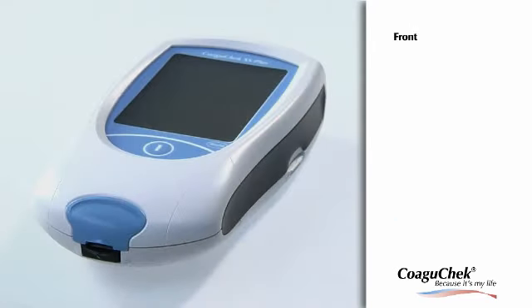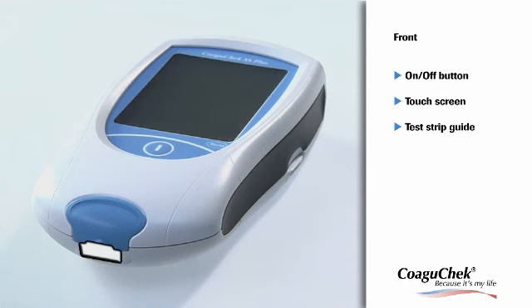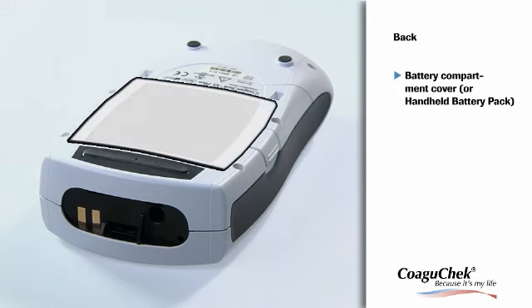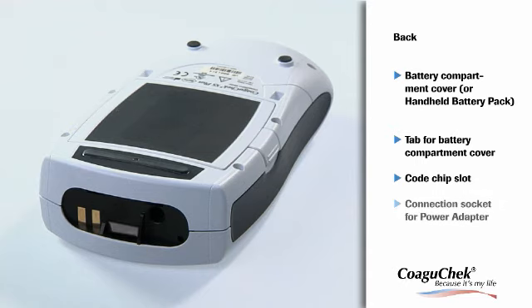Let's have a look at the front of the meter. Press the On-Off button to turn the meter on or off. The touch screen makes the meter very easy to operate. Test strips can be inserted into the test strip guide below the measurement chamber cover. At the back of the meter, you will find the battery compartment cover and a tab to lift the cover. The code chip slot is at the top of the meter — this is where the code chip has to be inserted. In the connection socket, you can plug in the power adapter.